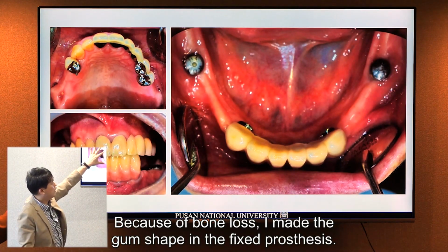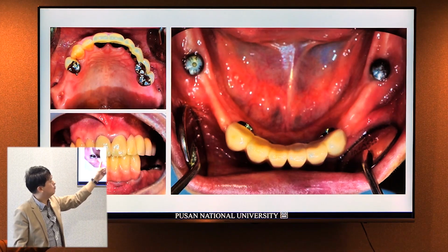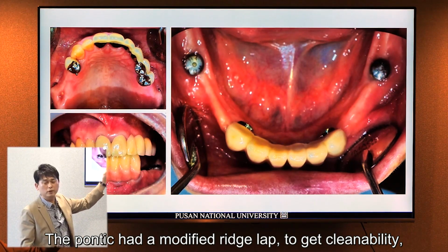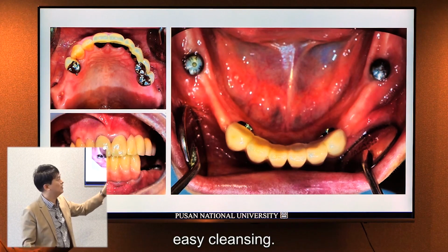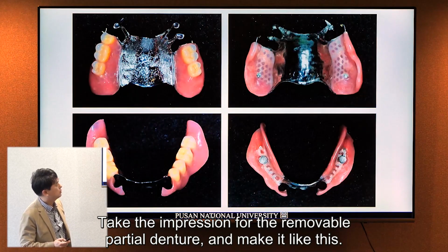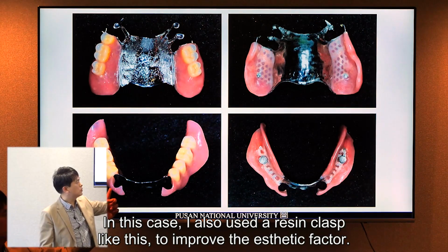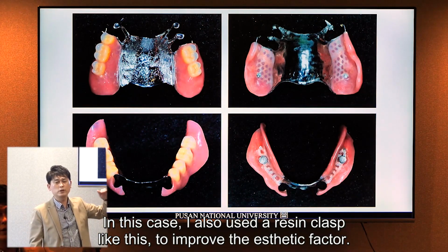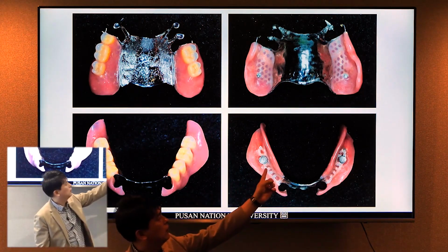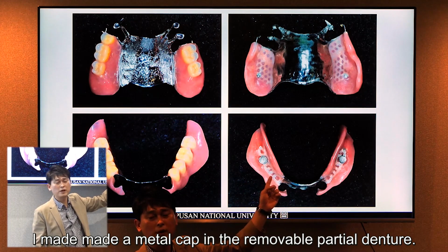Because of the bone loss, I made the gum-shaped fixed prosthesis. The pontic has a modified ridge lap for easy cleansing, okay? So I took the impression for the removable partial denture and made it like this. In this case, I also used a resin clasp like this to improve the aesthetic factors. And then look at this, I made the metal cap in the removable partial denture.